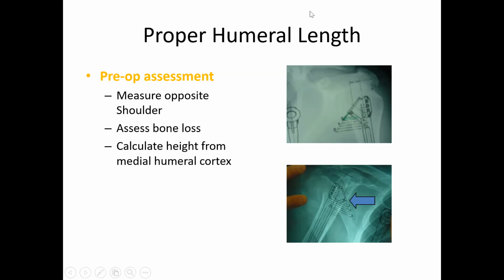For the fracture stem positioning, there are many jigs to help us to just place the stem, either external fracture jig or intramedullary positioning sleeves. But all these jigs are awkward to use, and to tell you the truth, it's very difficult to use them intraoperatively, and I do not use them because I find that it's very difficult to use them.